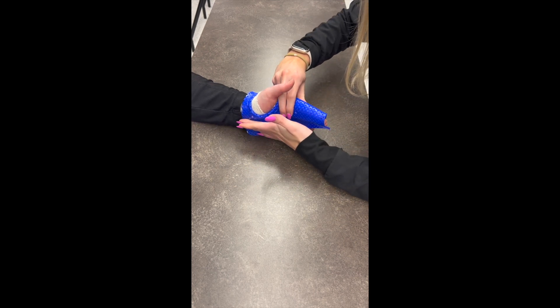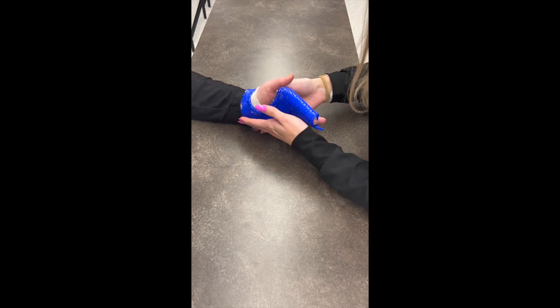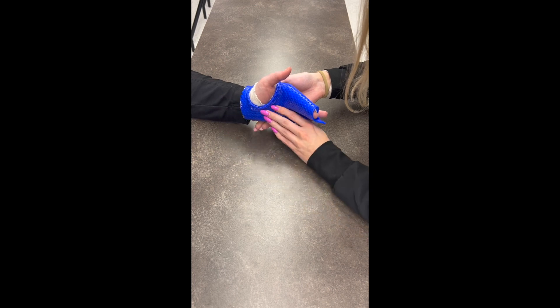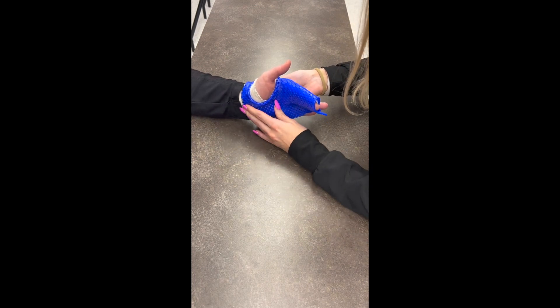Position the fingers in intrinsic plus, which is full IP extension and MP flexion. You want to get a good fit in the palm, and be sure the thumb will not be limited by the material.